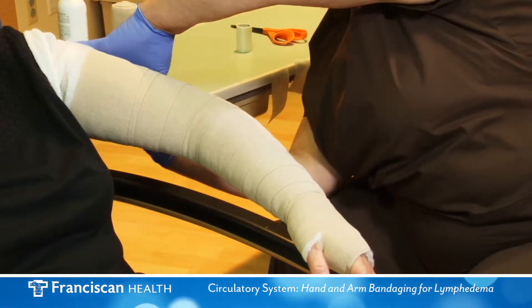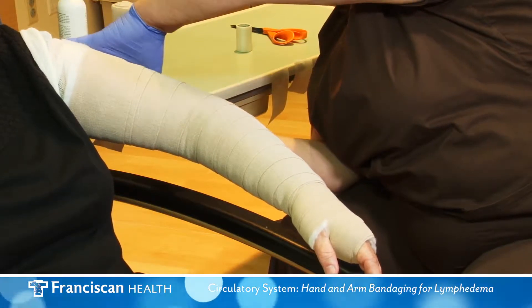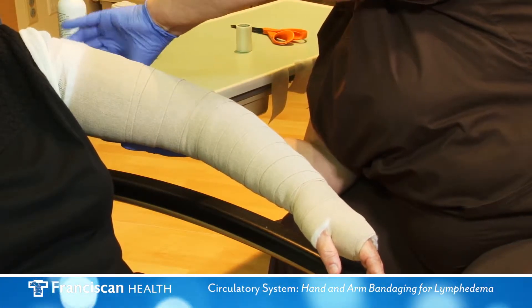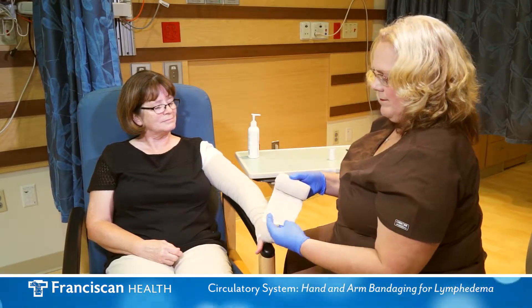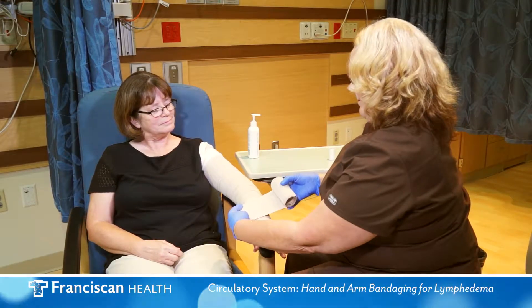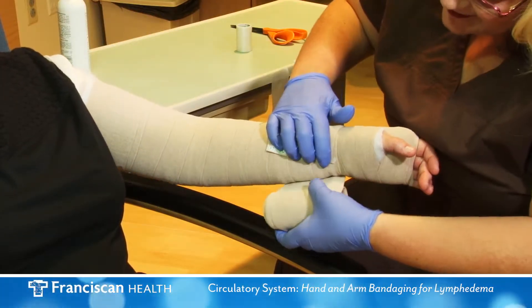Secure all bandages with tape. The fourth and last bandage starts at your wrist and spirals up the arm to the underarm.